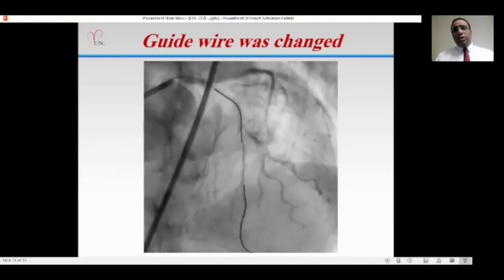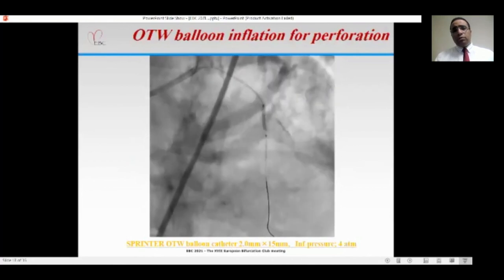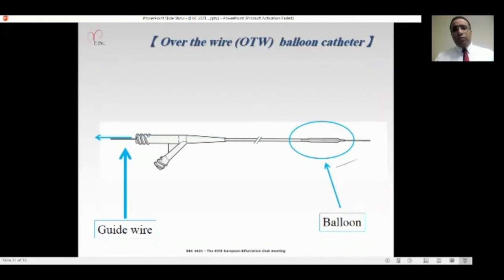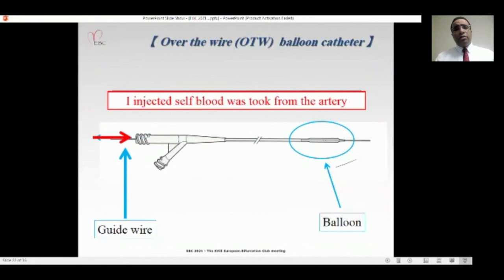I put in a long wire, 300 centimeters. Then I put the over-the-wire balloon over the wire, inflated it and pulled back the wire, and I injected self-blood into the wire lumen of the balloon, by putting another sheath in the contralateral femoral artery, taking self-blood, and re-injecting this blood into the wire lumen of the over-the-wire balloon. This is the principle of this technique: I pull back the wire, inflate the balloon, and inject self-blood into this lumen.